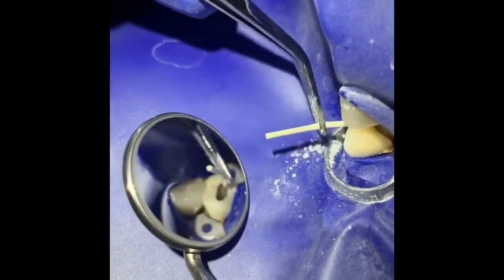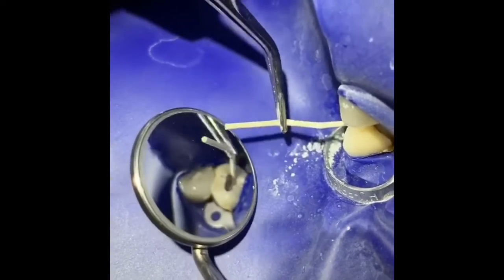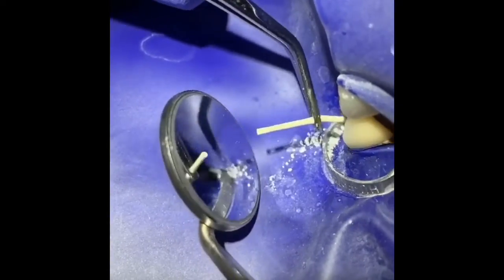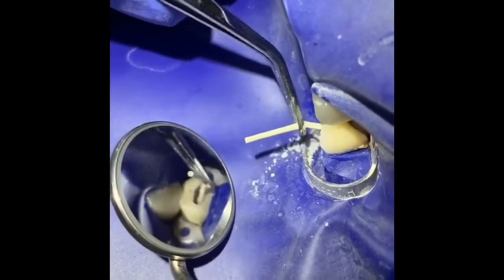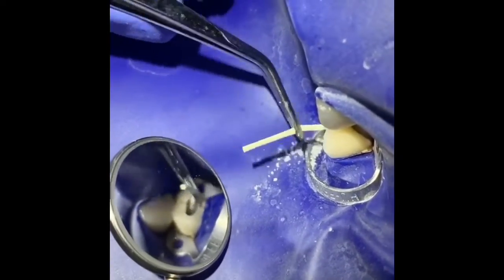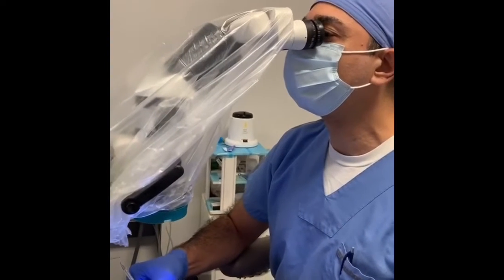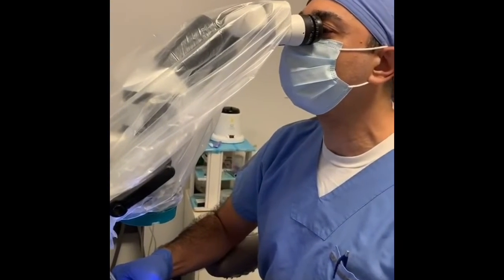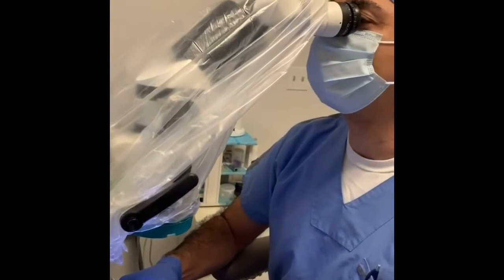The next thing I'm going to do is put a little gutta-percha and sealer over the MTA to fill the rest of the root canal. Everything is done under the surgical operating microscope, so we are done with this tooth.